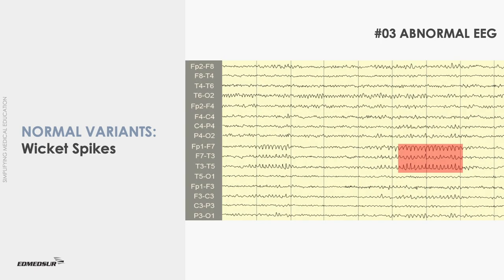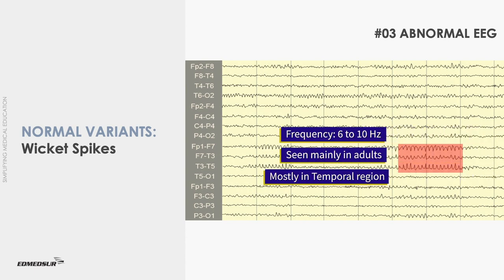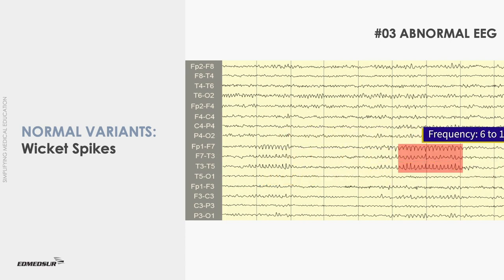Wicket spikes are frequently encountered benign variants with arch-like morphology, often seen in clusters. They have a frequency of 6 to 10 Hz and amplitude ranging from 60 to 100 microvolts. Wicket spikes are mainly seen in adults during drowsiness and light sleep, most frequently in the temporal regions, occurring unilaterally or bilaterally in an independent manner.